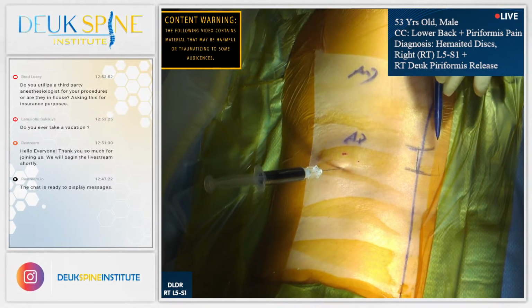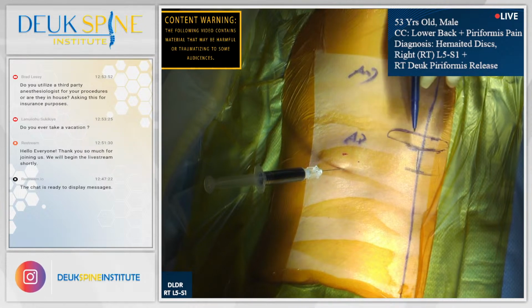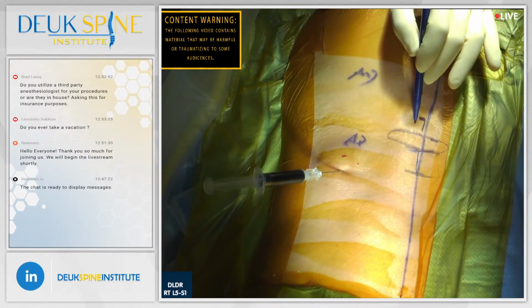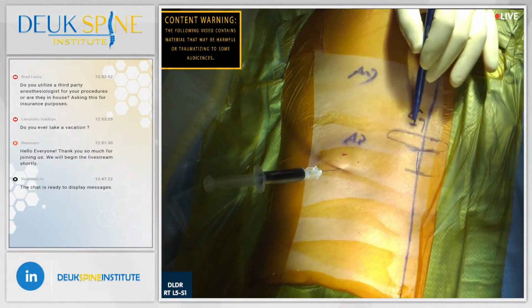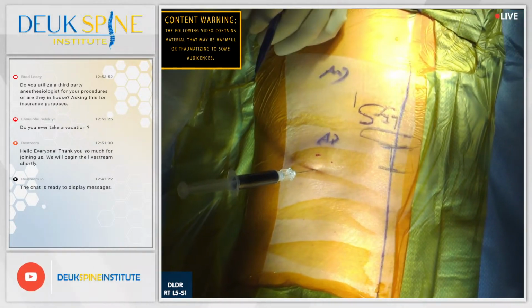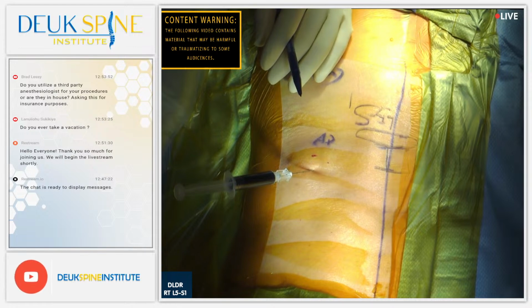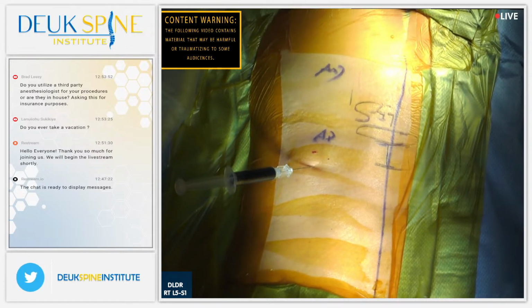How you doing, my friend? You okay? All right in there? Hi. Okay? Let me know when he's ready. His symptoms are foot neuropathy. Yeah, he has numbness, but he will get more back pain if we don't fix this. You think he's ready? All right, let's proceed.